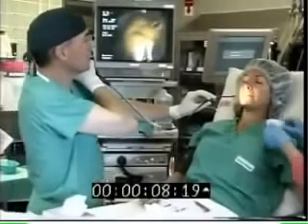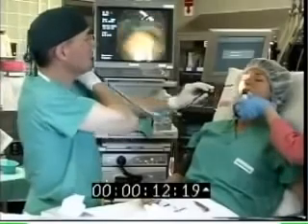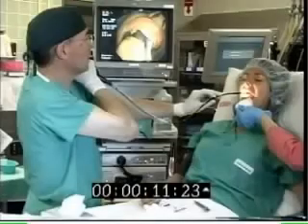Extension at the atlanto-occipital joint moves the epiglottis anteriorly away from the posterior pharyngeal wall and facilitates passage of the bronchoscope through the pharynx. It is our preference to perform the intubation facing the patient, as standing at the patient's right side facilitates negotiation of the natural C-shaped curve of the airway with the scope, permits easy visualization of the patient monitors, and maintains eye contact with the patient.